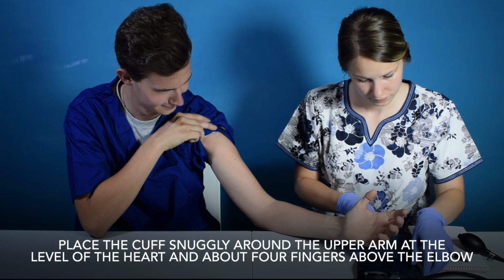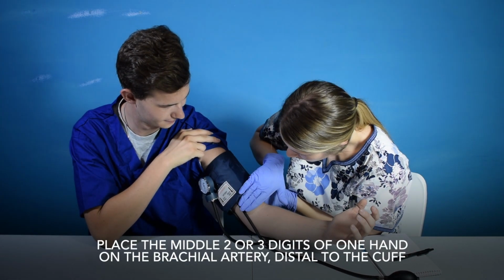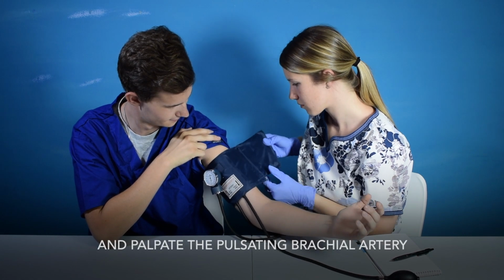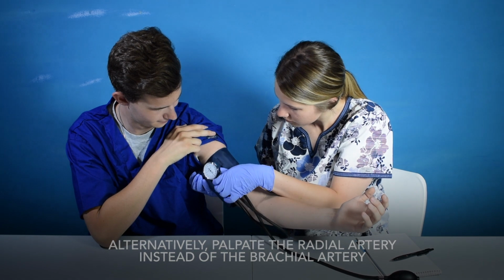Place the cuff snugly around the upper arm at the level of the heart and about 4 fingers above the elbow. Place the middle 2 or 3 digits of one hand on the brachial artery, distal to the cuff, and palpate the pulsating brachial artery. Alternatively, palpate the radial artery instead of the brachial artery.